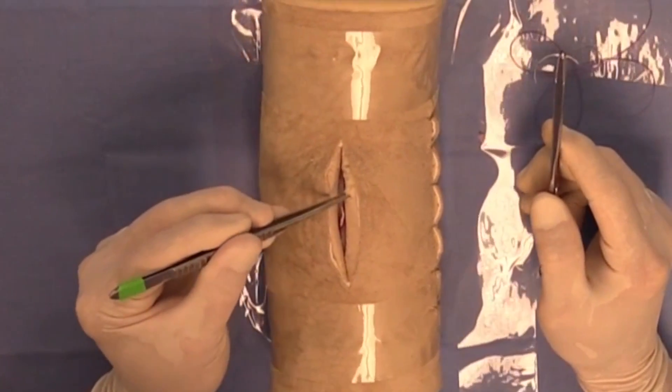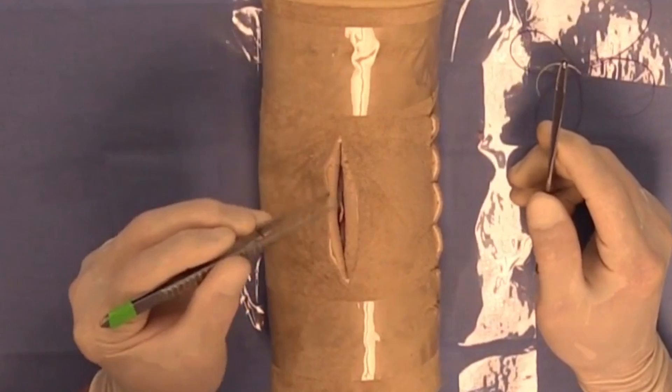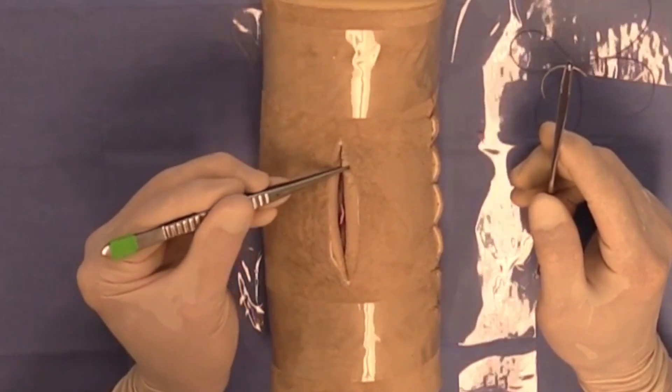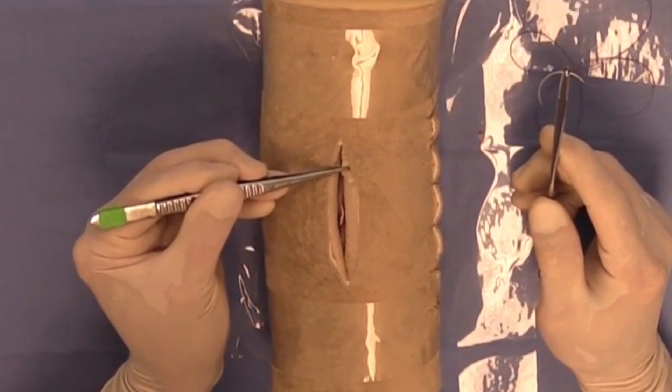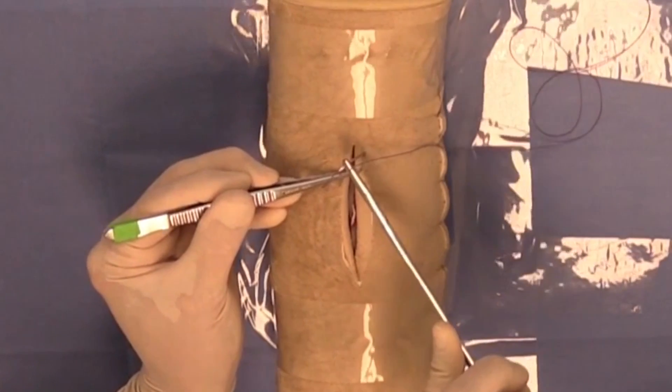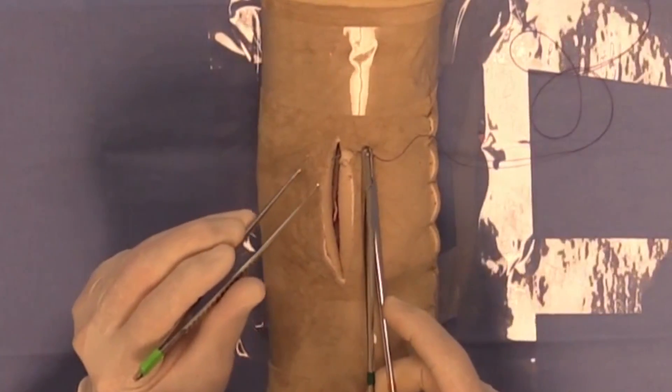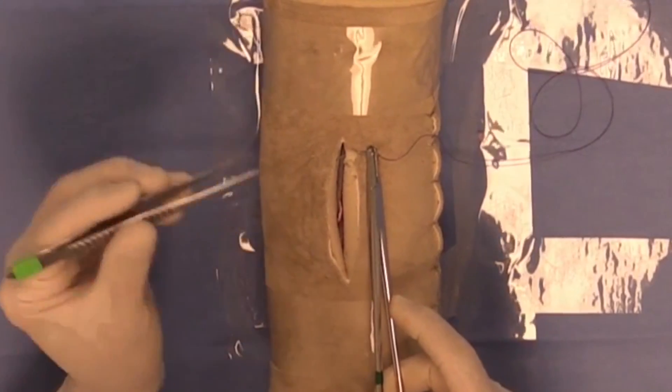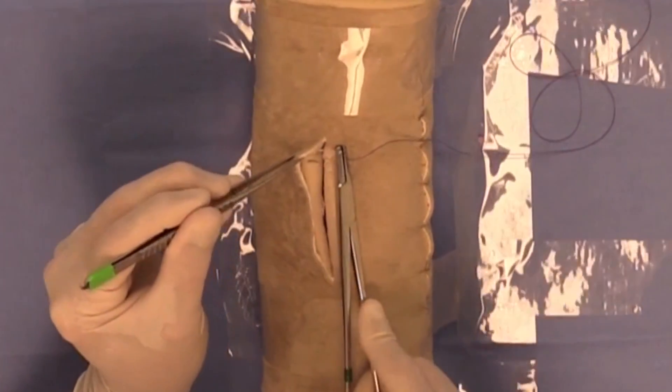Again, it's even hard to demonstrate what the subcutaneous tissues are using this portion of the DAISY. So we're going to assume that this foam part of the DAISY comprises the subcutaneous tissues. You can do an interrupted subcutaneous suture pattern but I'm going to demonstrate a continuous subcutaneous suture pattern because it's by far the most common pattern that you use in the subcutaneous tissues.